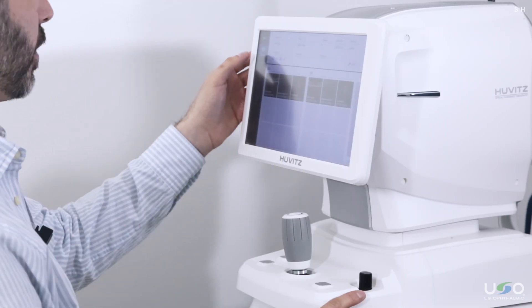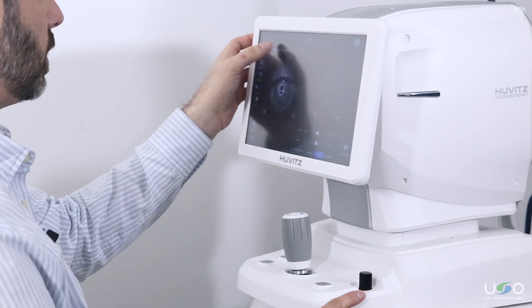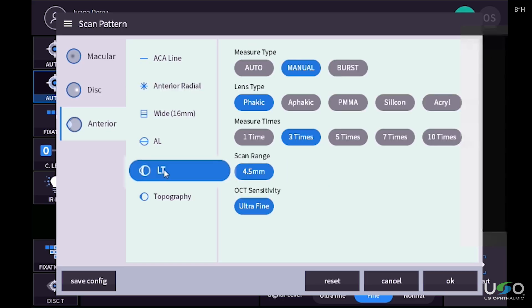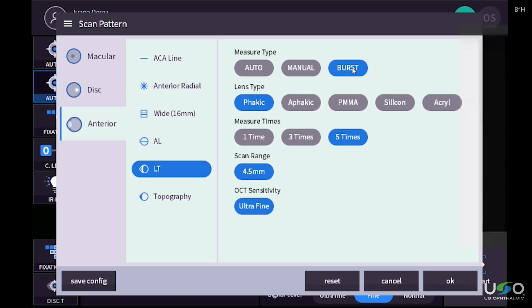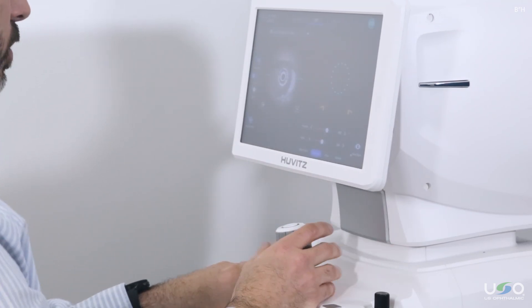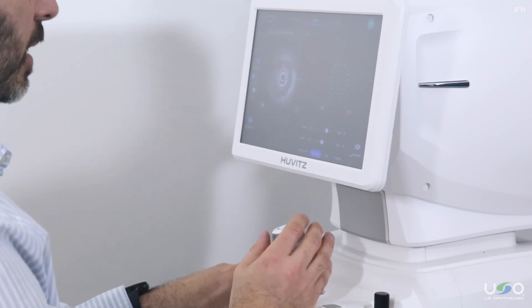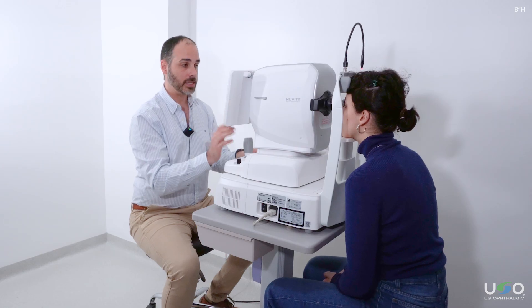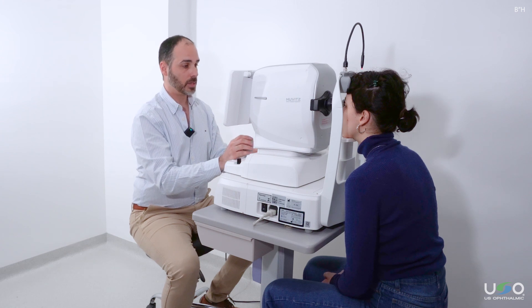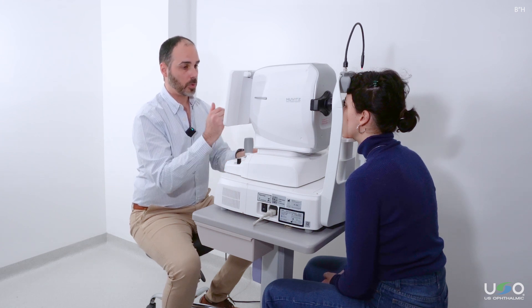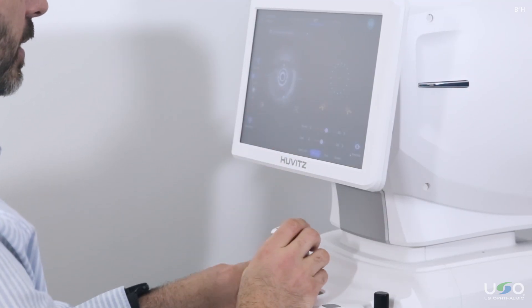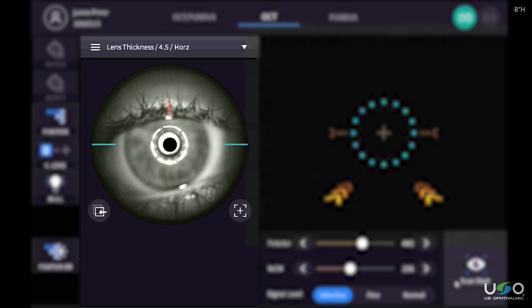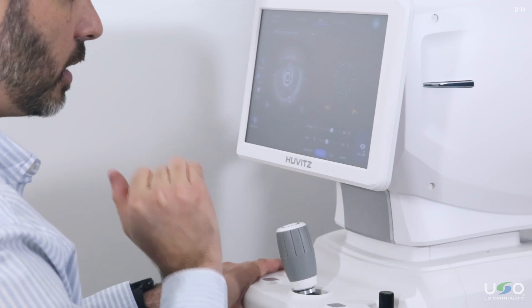Once the axial length measurement is complete, we can go to the measurement tab to select lens thickness. In this case, we will again choose the burst option. We can choose the type of lens, with five measurements continuously. Click OK. First, with the instrument pushed back, we are going to tell the patient to look at the green light in the center and not to be distracted by the red lights of the scan. At this moment, the patient can blink occasionally while we do the alignment ready for the measurement. Looking at the video on the left side, we are going to center it with the pupil and slowly come closer and press scan start.